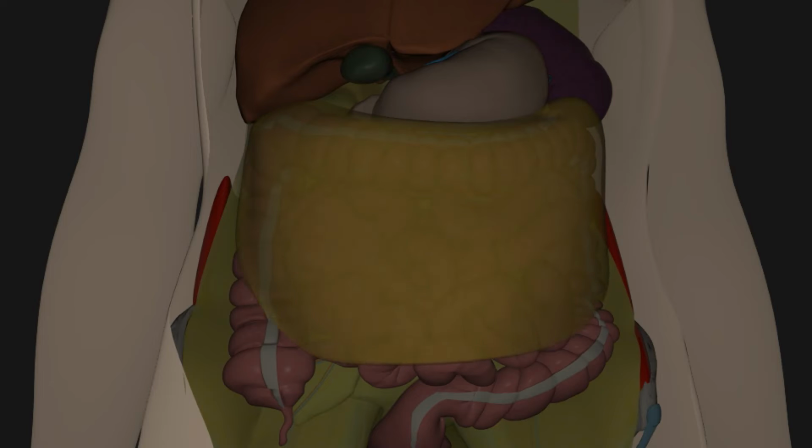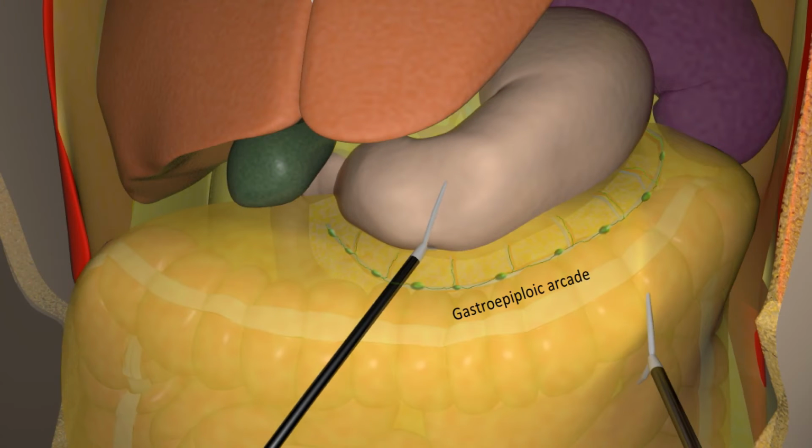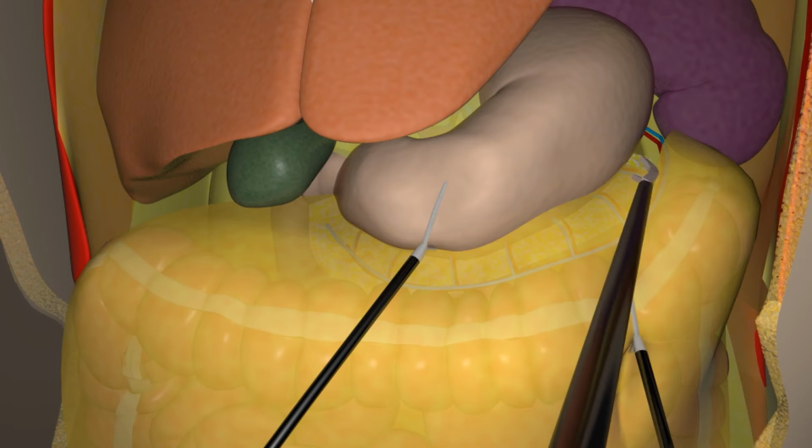Then, because of the risk of lymph node metastasis along the gastroepiploic artery, the greater curvature of the stomach should be skeletonized and the left side of the omentum must be included in the specimen, at least 10 to 15 cm from the tumor at the splenic flexure.